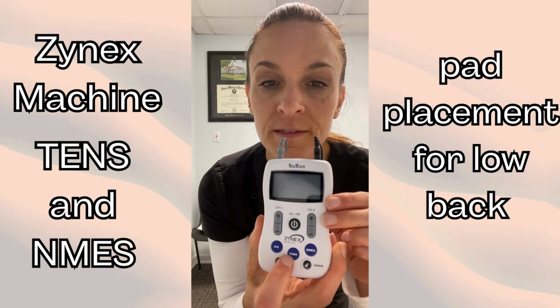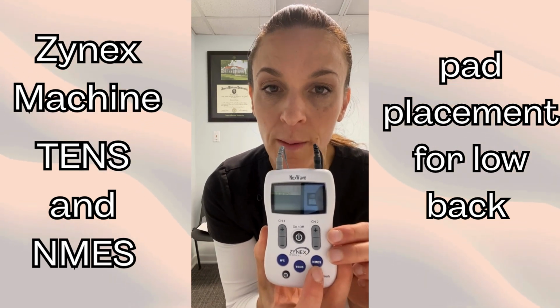Actually, both the TENS and the NMES setting for the pad placement is identical. So for our purposes, I'll go ahead and turn it on to the NMES setting here. And I generally recommend that that little arrow is right next to the 10 by 10, which means it's 10 seconds on, 10 seconds off.